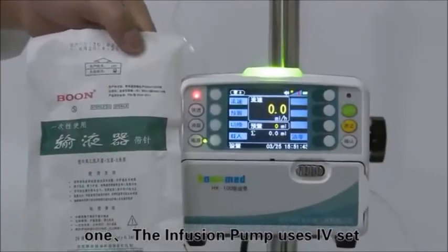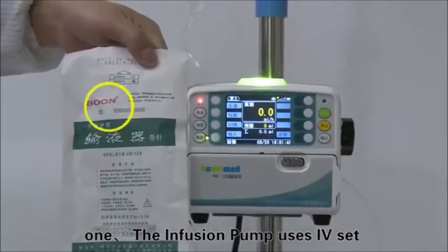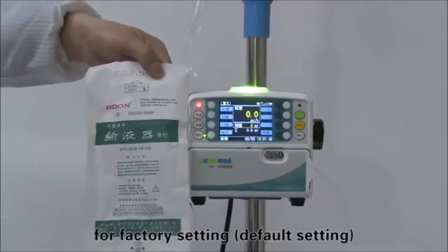Make calibration and verification when changing to a new brand of infusion set. The infusion pump uses IV set under the brand of BOON as its factory setting.